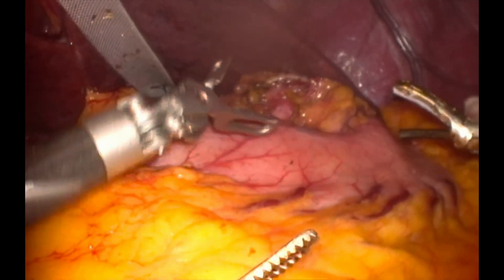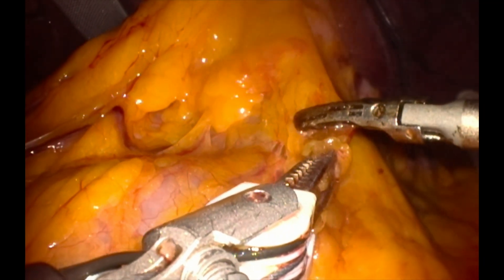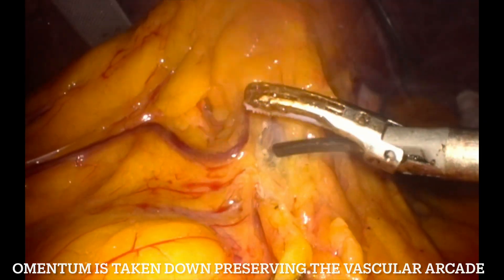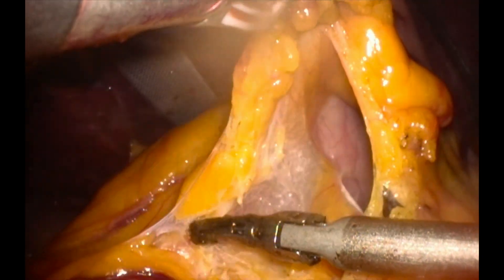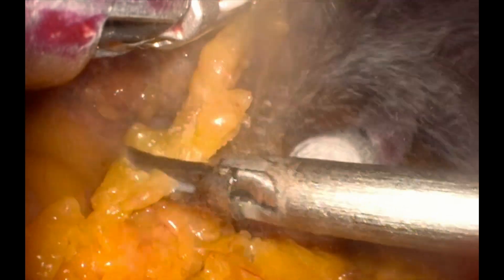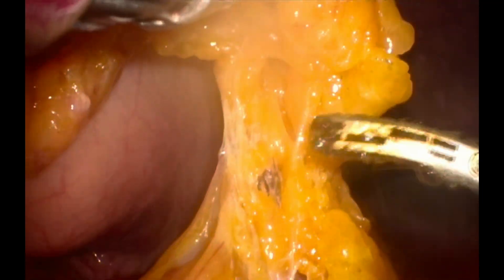Once dissection is done, we go to divide the greater omentum. We lift the stomach and a gentle traction on the transverse colon makes the omentum taut. We have to be very careful not to injure the vascular arcade of the stomach along the greater curvature. Once the lesser omentum is opened, it is a cakewalk — you can easily divide the omentum with retraction from R3 lifting the stomach and counter-traction from the assistant along the transverse colon. Be careful not to injure the transverse colon here.